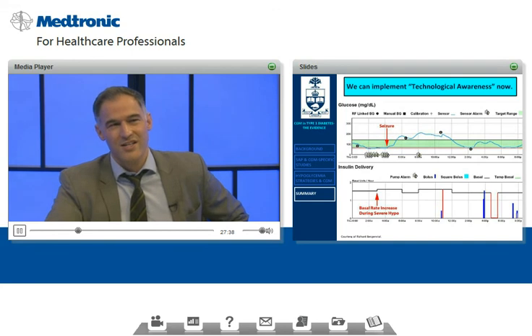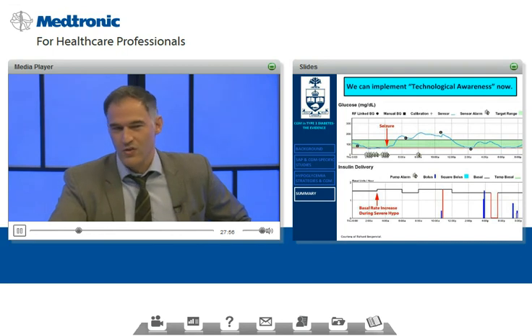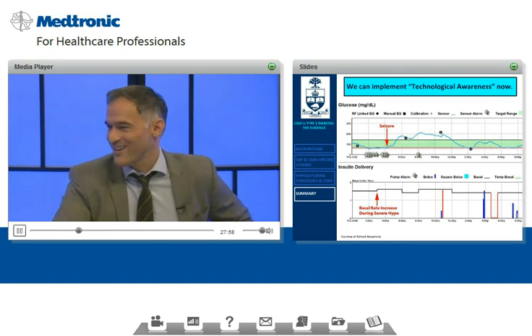And on that night, that's definitely not what they needed. And the fact that our devices have the ability to detect hypoglycemia and adjust how a basal is delivered really means that we need to commit to this kind of technology to help our patients with type 1 diabetes. So with that, I'll return the podium to Josh.